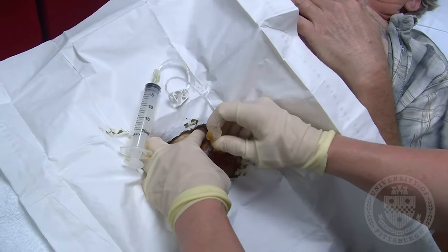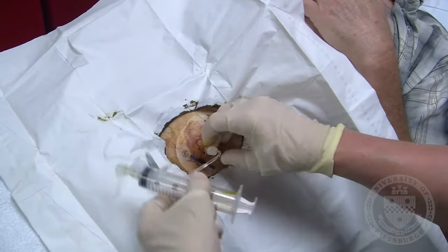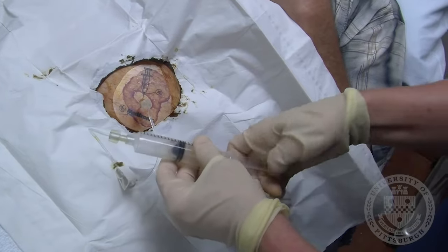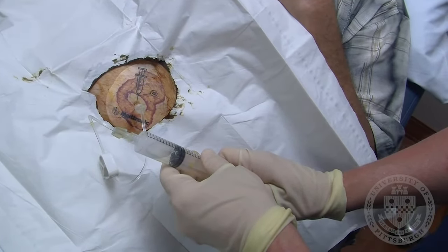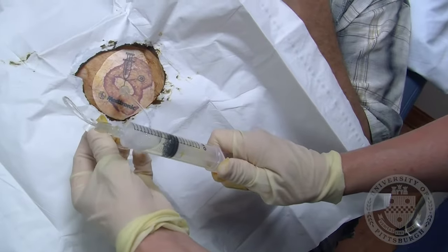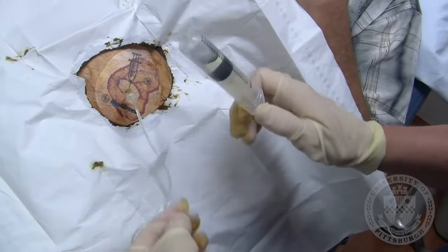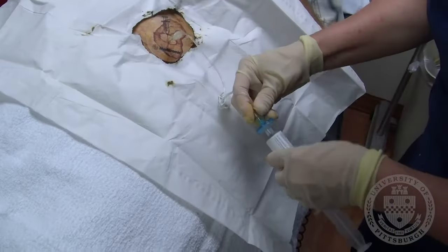A small needle is inserted through the skin and into the port — you will feel a small pinch. The old medicine remaining in your pump is withdrawn using an empty syringe. With the needle and catheter remaining in place, the syringe is removed and the old medicine is discarded.